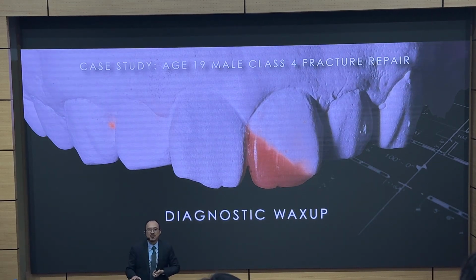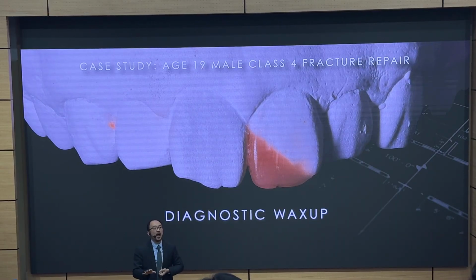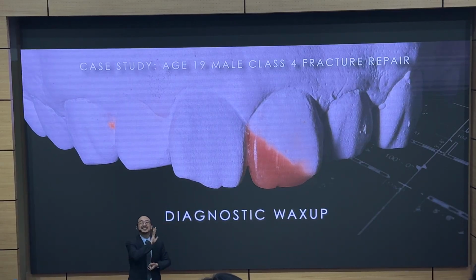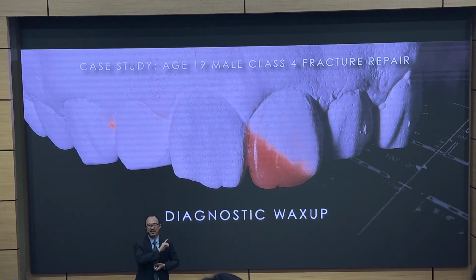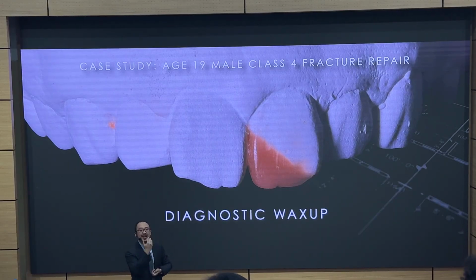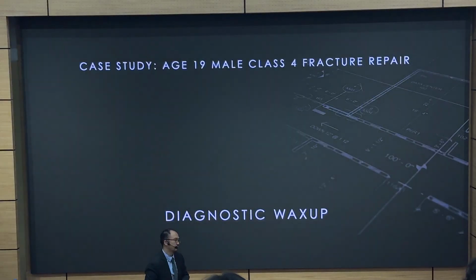I have no time to do a wax up. I do not want to do a wax up. I know, I understand. I still do this, but very rarely. I'm going to go through other methods as well to create the palatal anatomy. But for this case, we did a wax up.